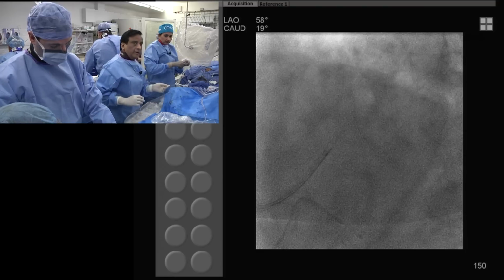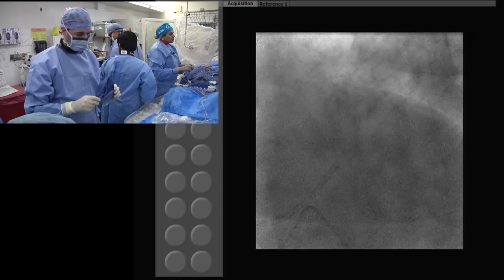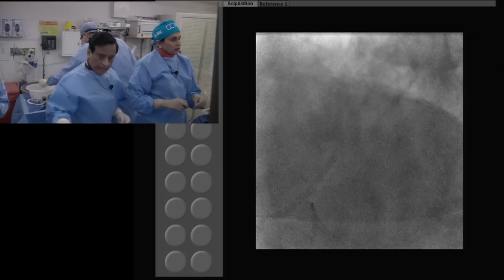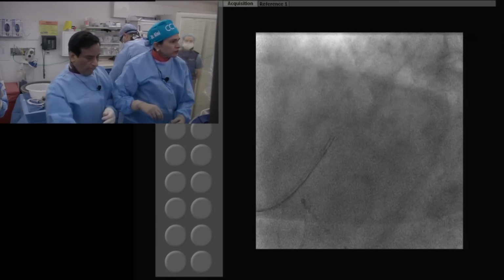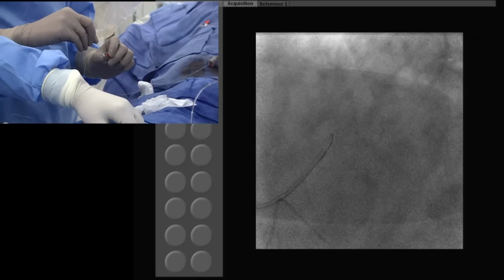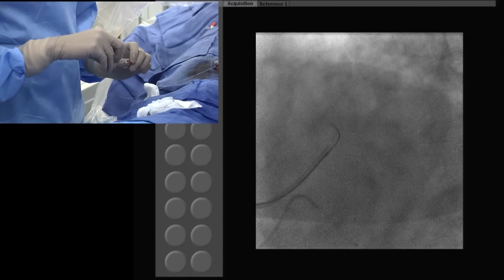So now we are trying to make a turn. This is the Miracle 3. Have the Supercross 120 ready, if you think you need it. Get the Supercross ready. They said no need, don't open. But that's okay, open it. Fine. Have it ready.